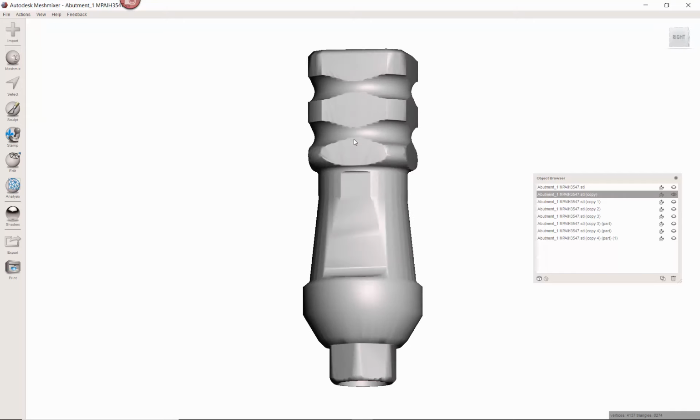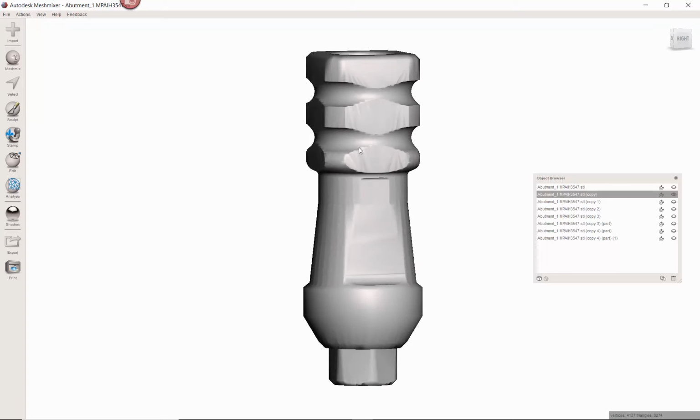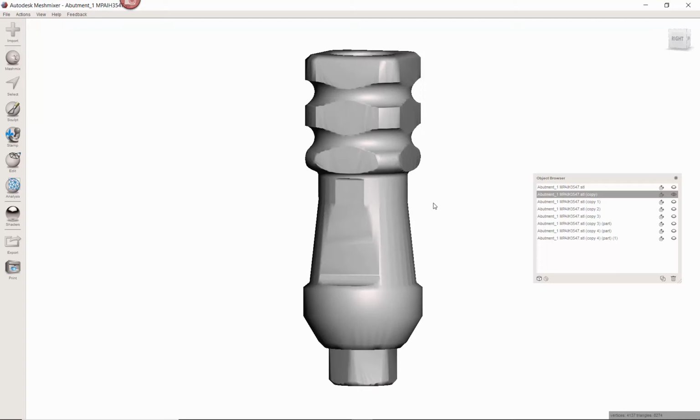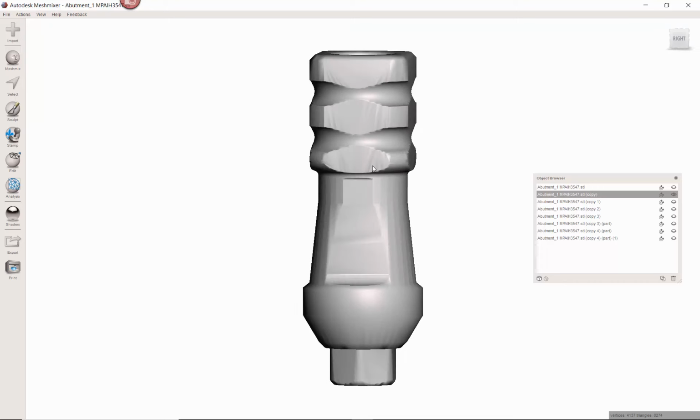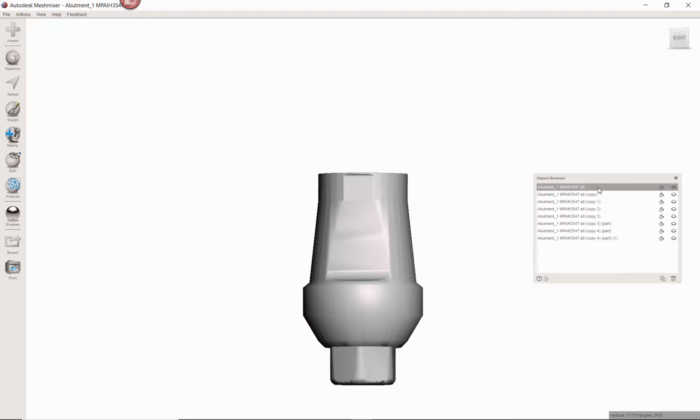But anyway, so this is one you might have. Lots of systems have these. I know that BioHorizons does. Implant Direct does. This is one from Blue Sky Bio. So lots of companies sell their implants with these. So if you wanted to use this in the software, that's fine. You can. What the first thing you're going to do is, I'm not going to be, this part's going to be cut off regardless. This top. So pretend this is the actual abutment you're going to be using.